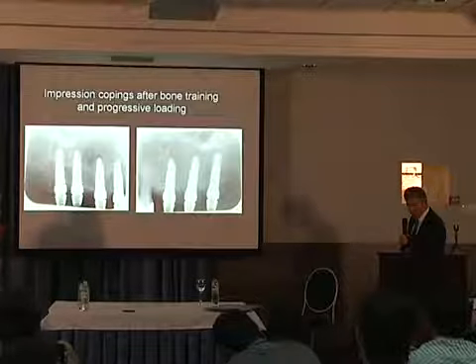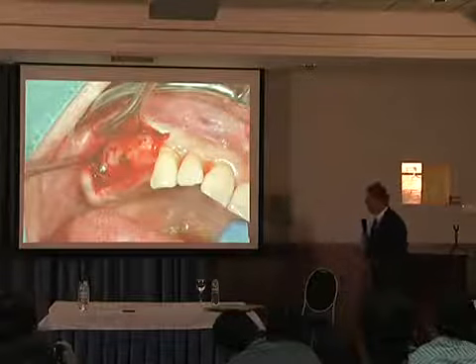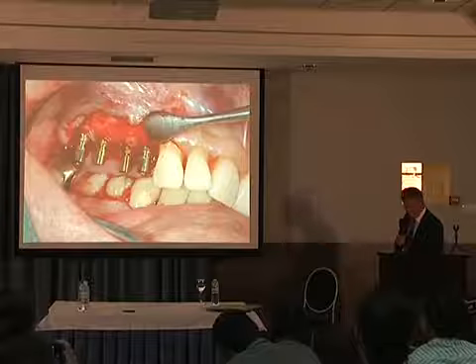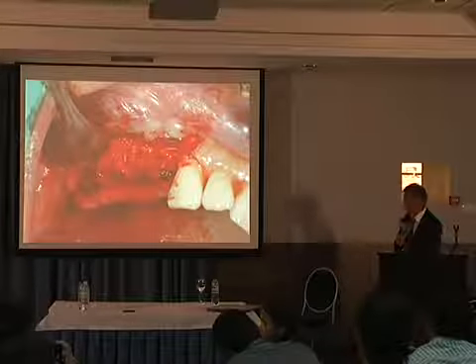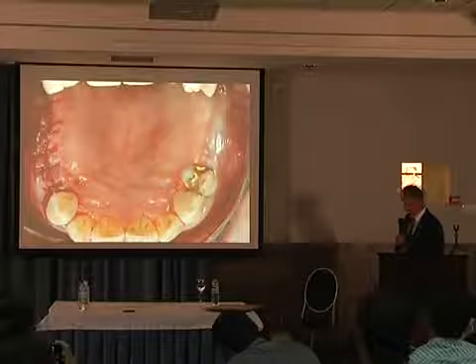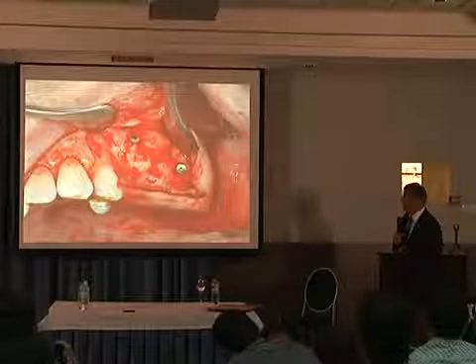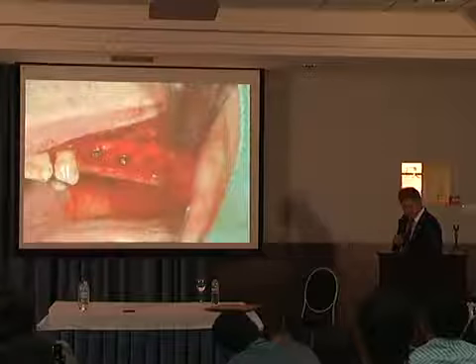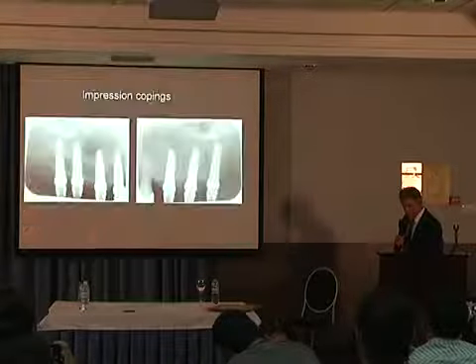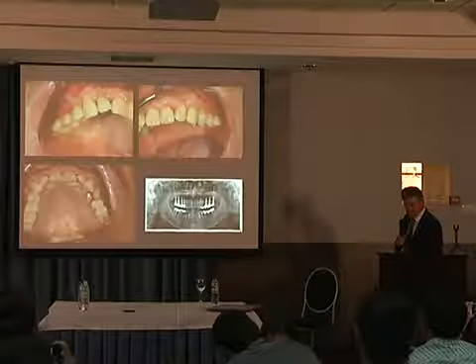Impression coping. Clinical situation. Снятие слепков. Remove the screw. Удаление винтов, которые фиксировали блоки. Place the implants. Размещение имплантатов. Biomaterial, buccal plate enough. Был положен костный материал. Stitches. Дефект был ушит. Left side, remove the screw. С другой стороны убрали винты, фиксирующие блоки. Place the implants. Установка имплантатов. Impression. Снятие слепков. Abutments. Try in.